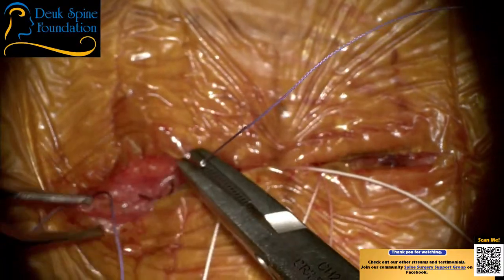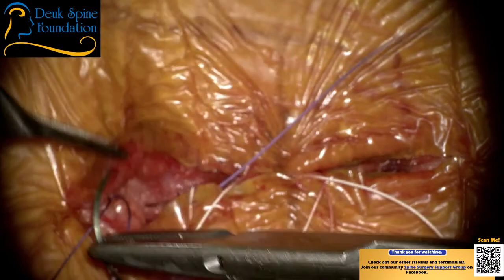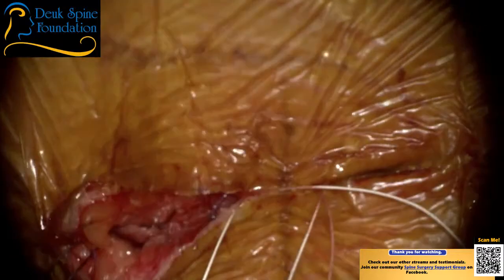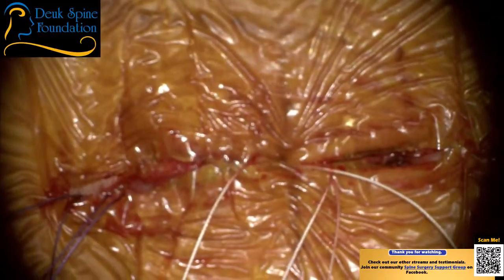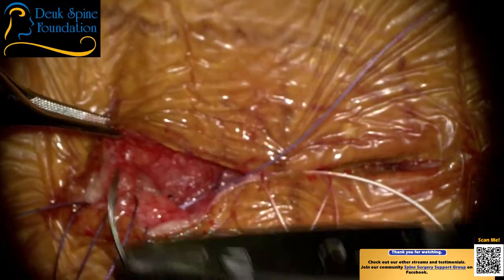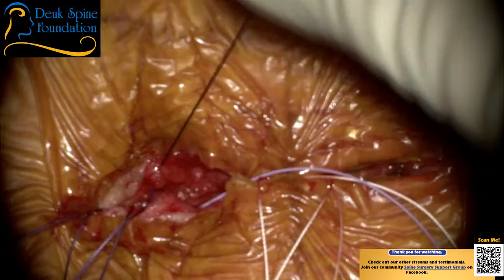This is an important suture because if you don't take the tension off the skin edges, the patients can get an ugly scar. So you want to get the pressure off the edges of the skin so that they can heal properly. And I see this step done wrong so much, not by me, but by other surgeons. Patient comes in and they've got a horrible looking scar that's really very wide, spread wide. It looks bad. So for cosmetic reasons, you want to make sure that the tension is off the skin edges.